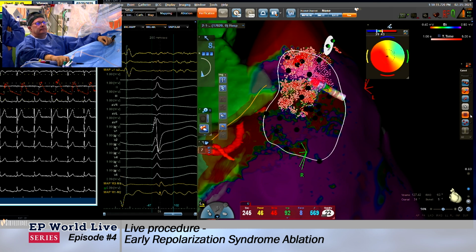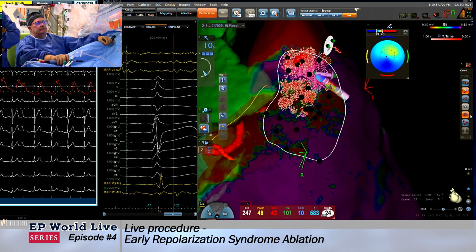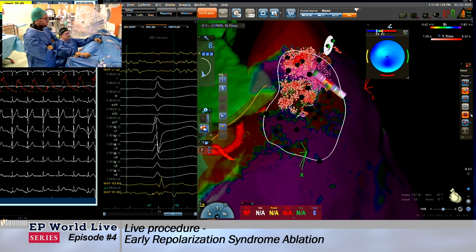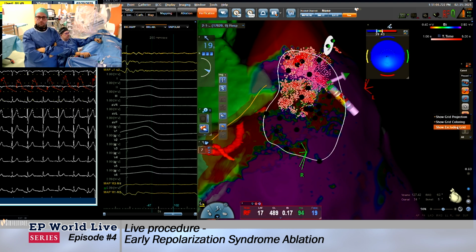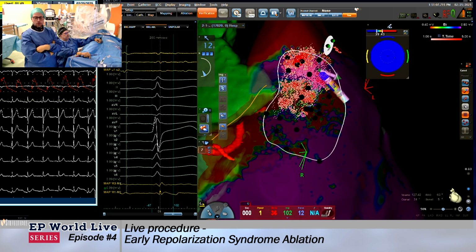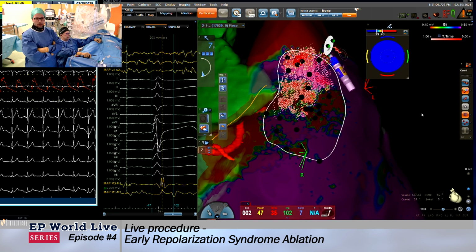By the way, can you show the ECG in the meantime while we are ablating? Because there is something interesting that we can show you. Go ahead with ablation, no worries. ECG, Alessandro.